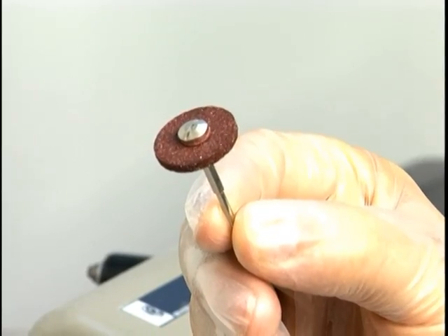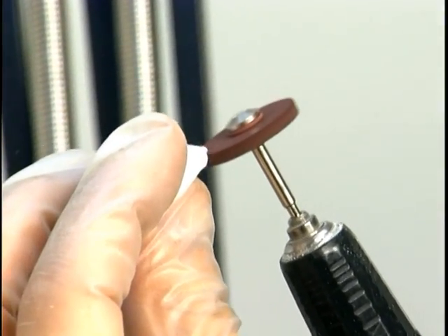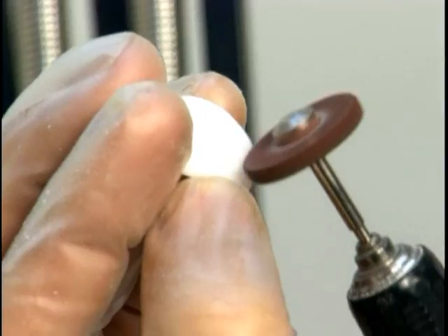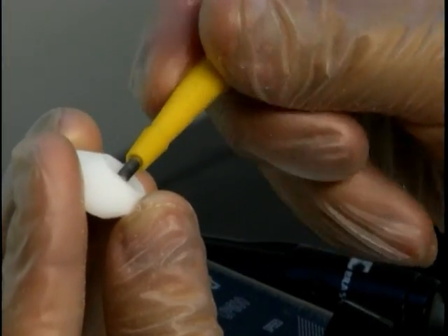Next, use an aggressive silicone bit. Make sure to grind the seam in an up and down motion rather than side to side. To prepare for painting, it is advantageous to prime the area around the iris button using a fine silicone bit. Finally, you may choose to create a recessed pupil by using a biopsy punch.